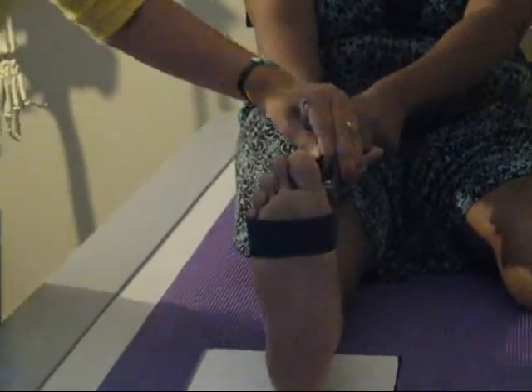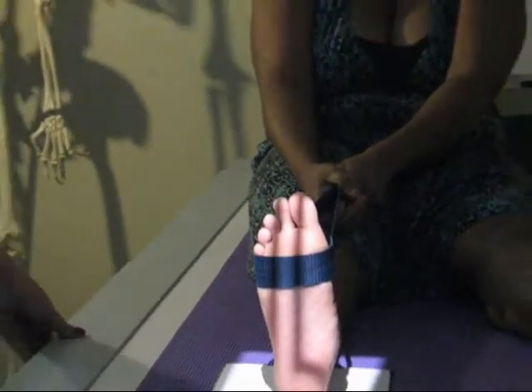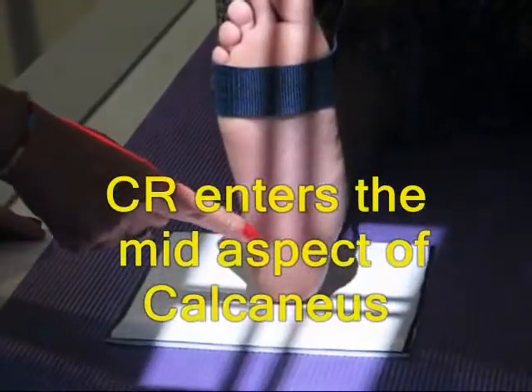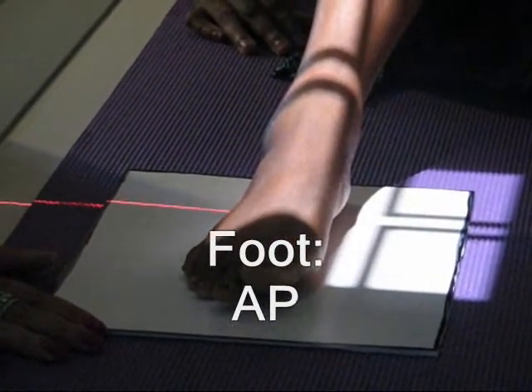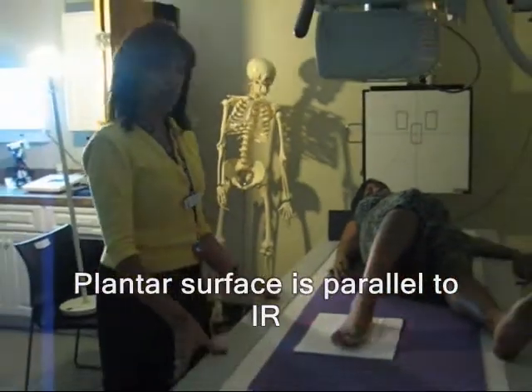You can use a bandage of some kind, a belt, it doesn't really matter, as long as it helps. You have the central ray right on the mid aspect of the calcaneus, still with the plantar surface of the foot touching the table.